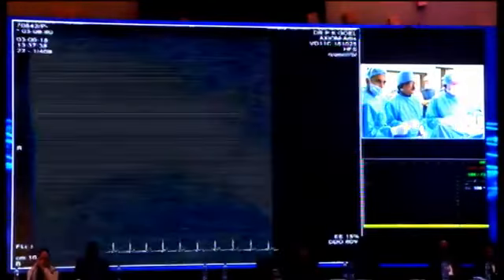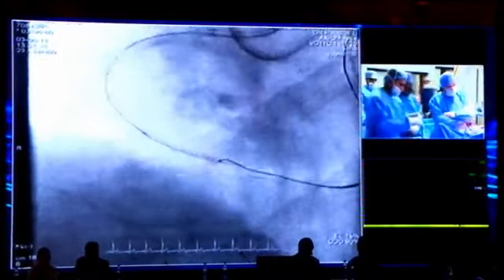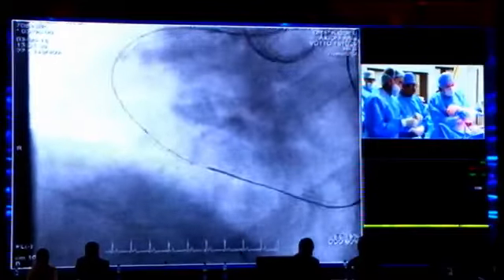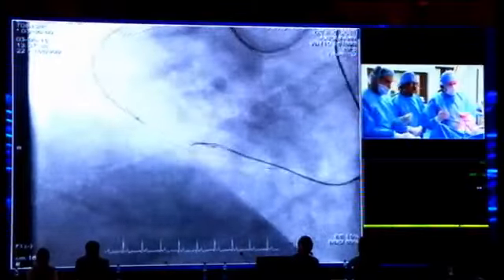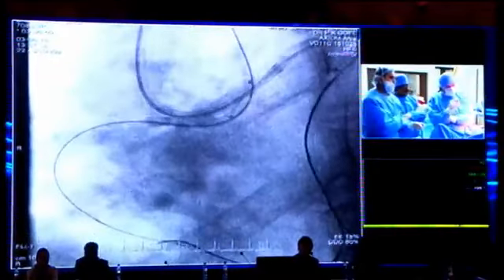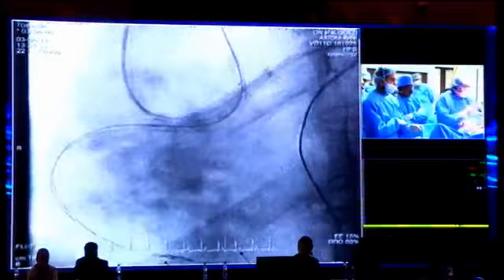Okay. So we brought a 2.0 balloon over the Fielder XT and inflated, and then I tried to get the Ultimate into the same space. I struggled a little bit, but finally we managed. We were thinking you could easily change to a Gaia, but first what you have to do is get the Corsair further up, maybe even in the distal cap. So that's still the process.